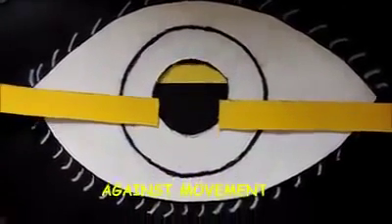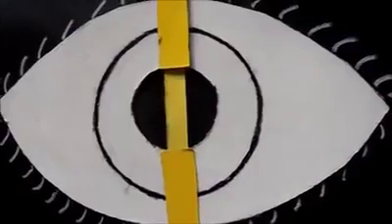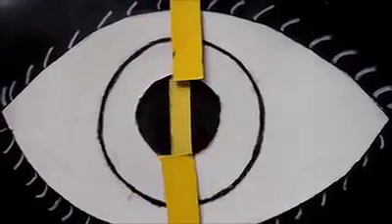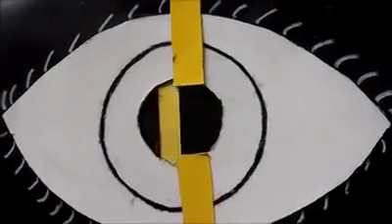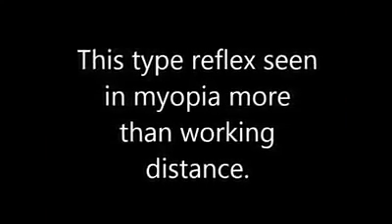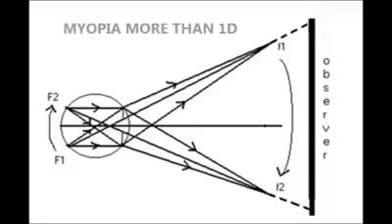Now, if the movement observed both horizontally and vertically is an against movement, that is, the pupillary reflex moves against the streak of the retinoscope, we neutralize such a reflex with a minus lens. This type of reflex is seen in myopia more than the working distance.